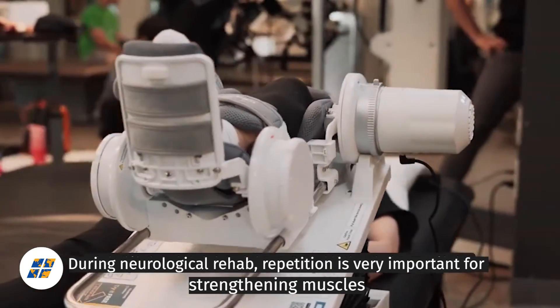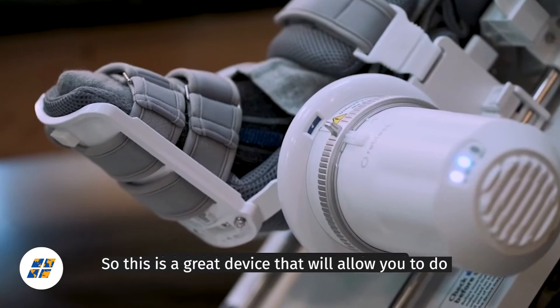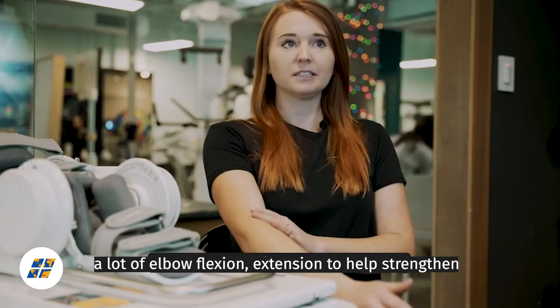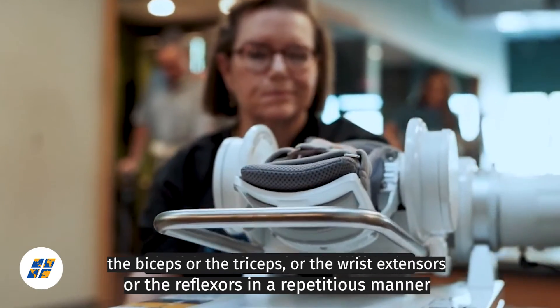In neurological rehab, repetition is very important for strengthening muscles, so this is a great device that will allow you to do a lot of elbow flexion extension to help strengthen the biceps or the triceps or the wrist extensors or flexors.